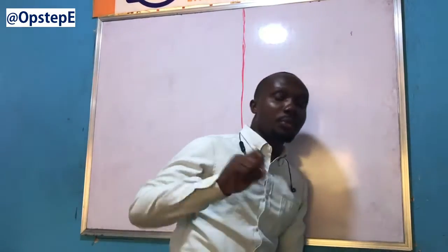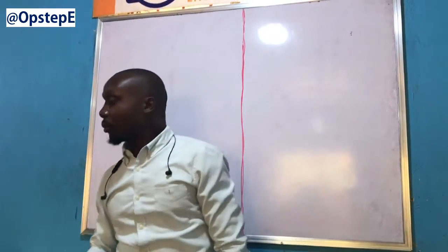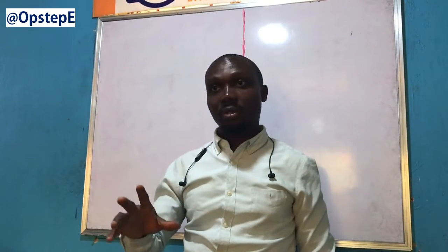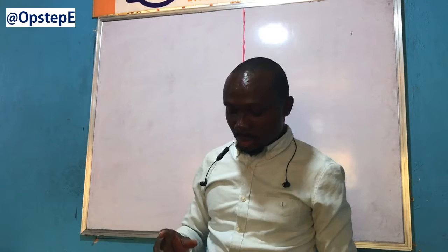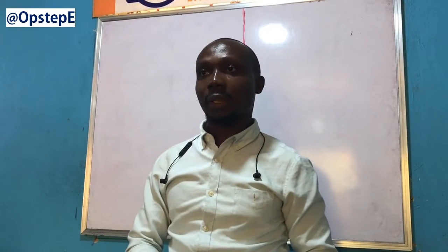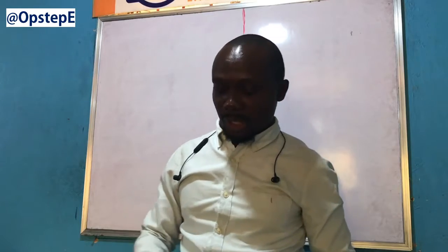What we will be doing this morning is some very quick explanation, discussing the electronic aspect of your work and then the programming aspects.